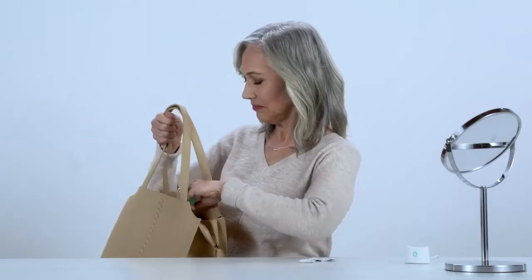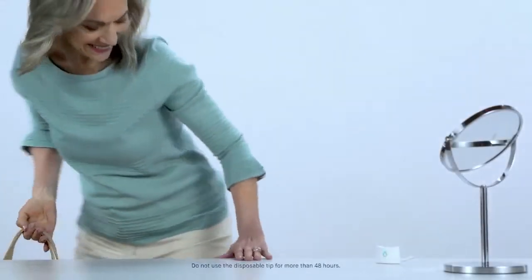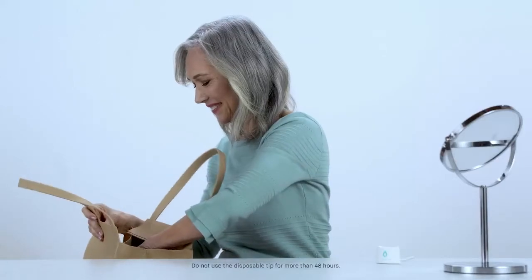Use TrueTear at least twice a day as needed. The tip should be replaced every 48 hours. Failure to replace the disposable tip will cause the hydrogel to dry out, and the TrueTear device will not work properly.